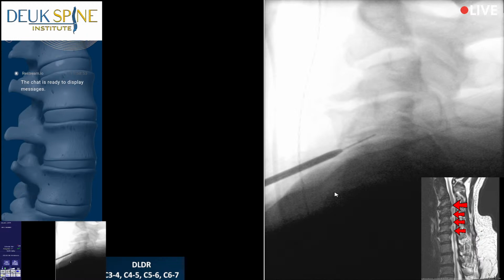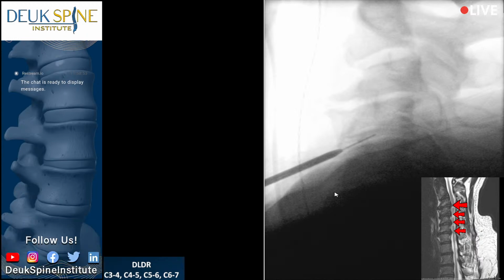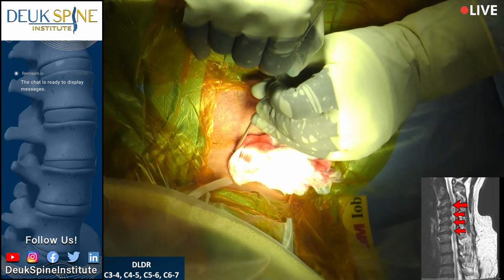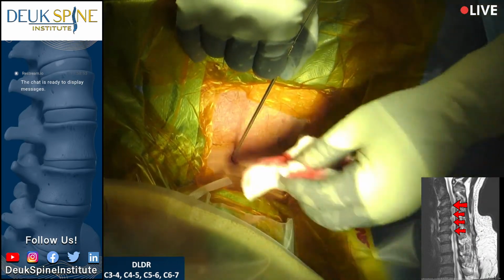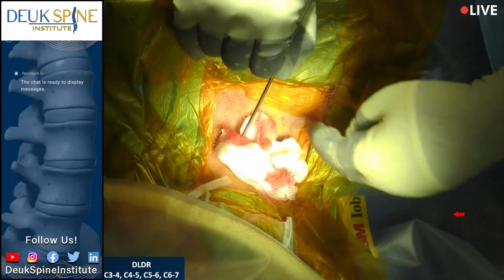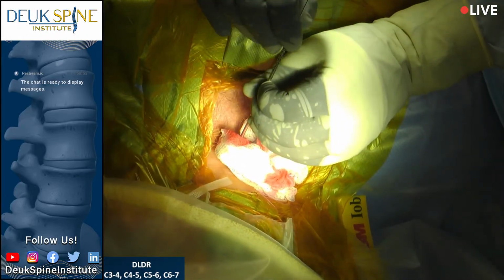We were just saying the nice thing about this patient's spine and neck is that I was worried the spine would be so far back from the front of the neck I wouldn't be able to feel it, but I was able to and safely get in. The downside, and the only thing that concerns me a lot here, is that his neck is short. So his window of operation for me to get in and move around is very narrow.